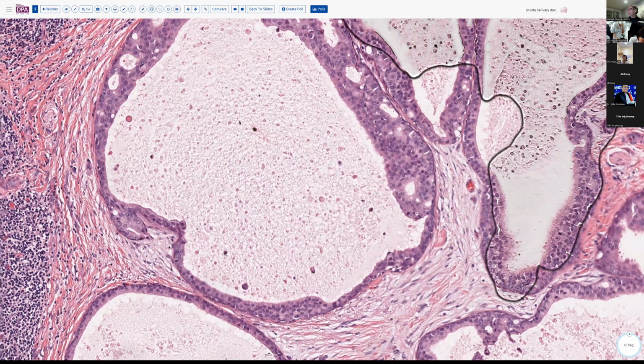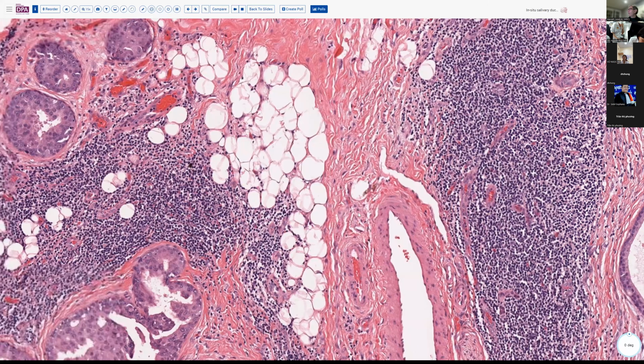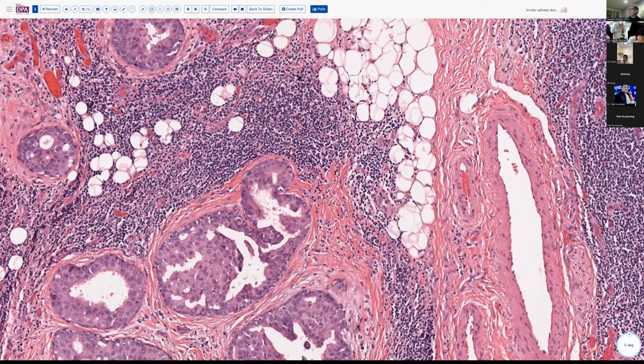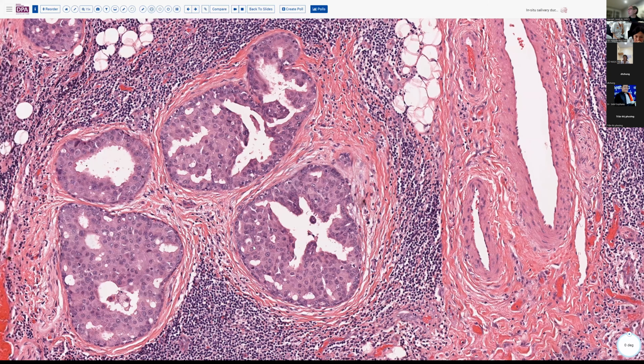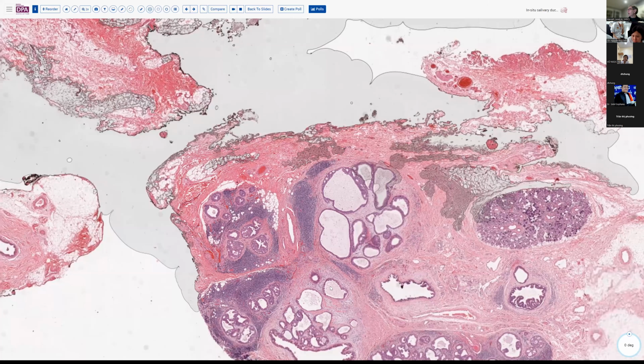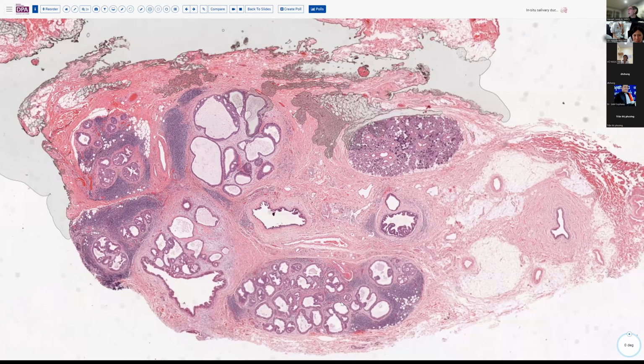And as it extends up into the lobular structures, you see it forming a little bit more almost solid type growth, sharply punched out cells, displacing other cells, and here, a good, reasonably high grade type of pattern of carcinoma. So what we saw in this case was pretty much all in situ type tumor with, as it were, cancerization of the lobules, as we say in the breast, and involvement of the ducts.